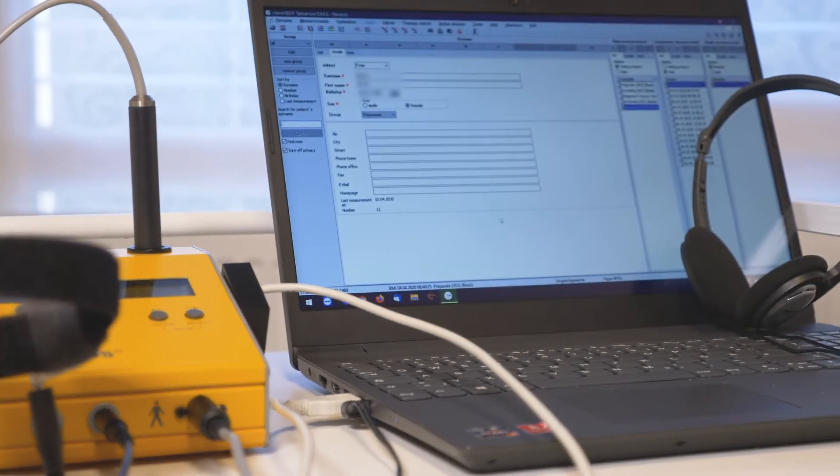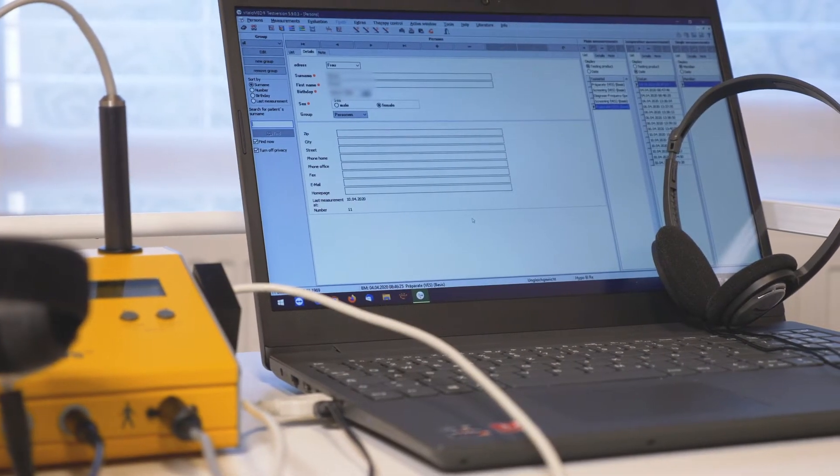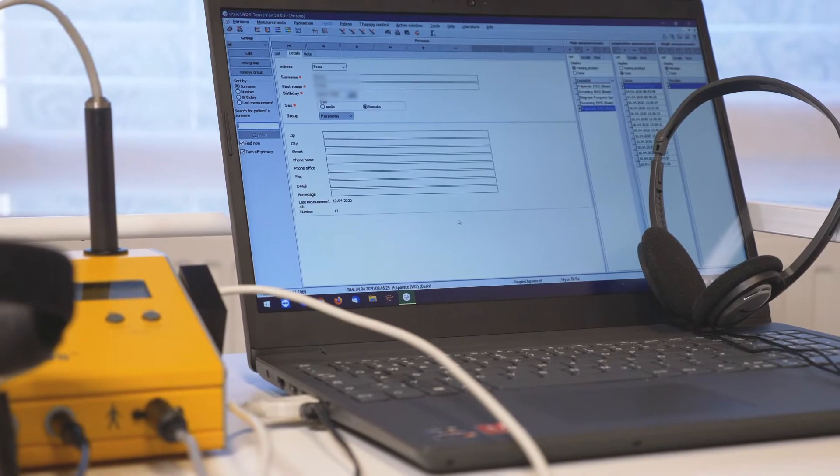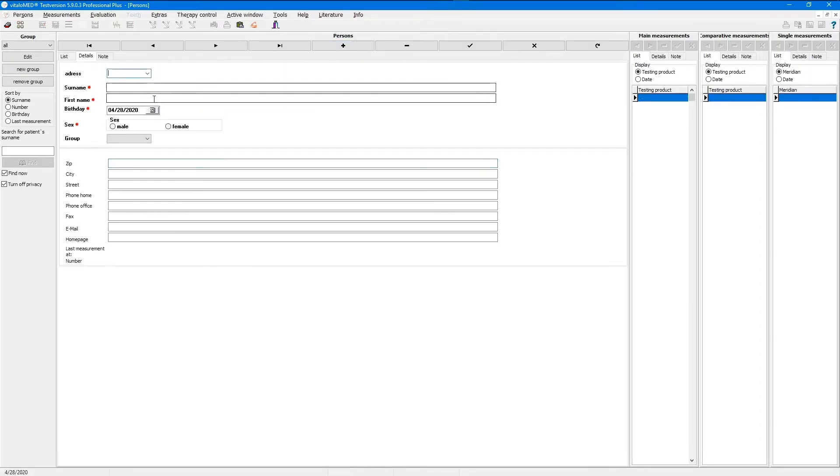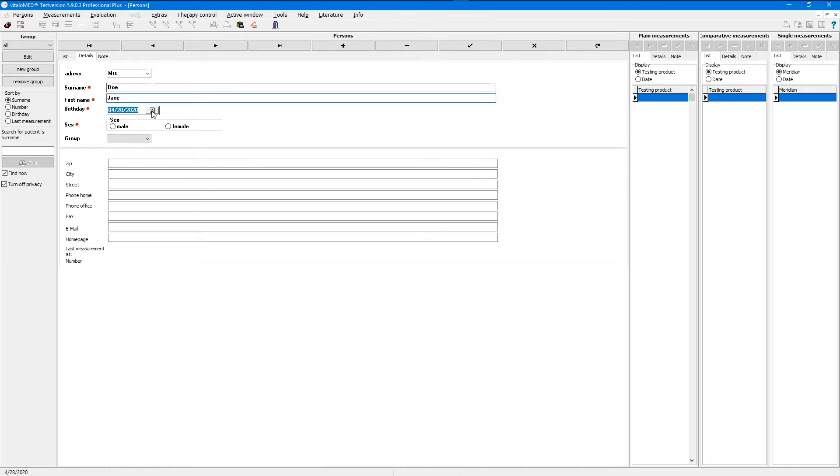First of all, we have to create the patient's personal data. Click the plus button to open a new file. The essential information is featured with a red dot. Needed is surname, first name, date of birth and sex. After registering these data, click the button with the check mark for saving.